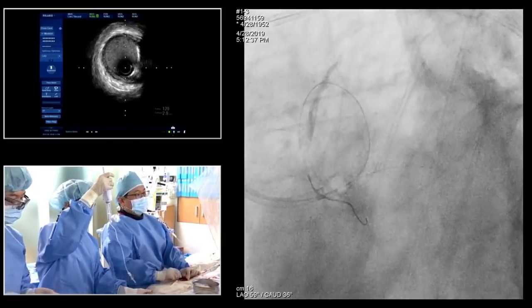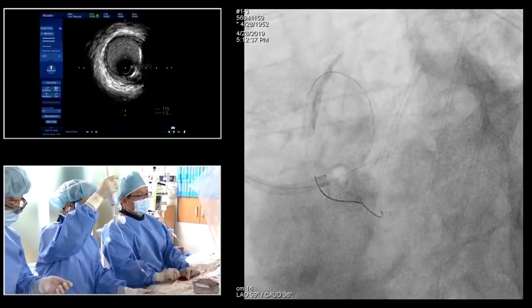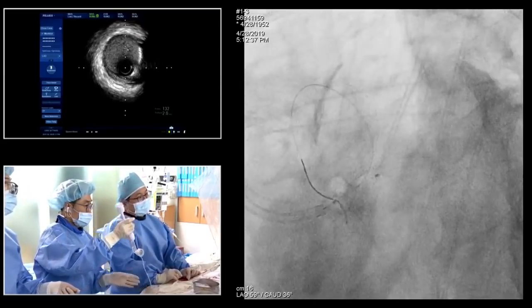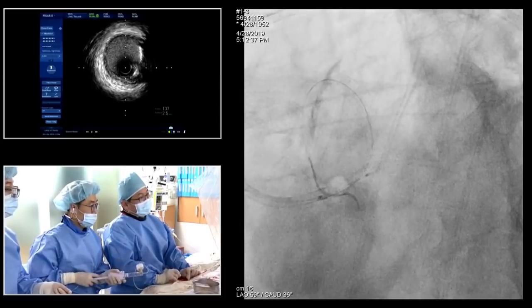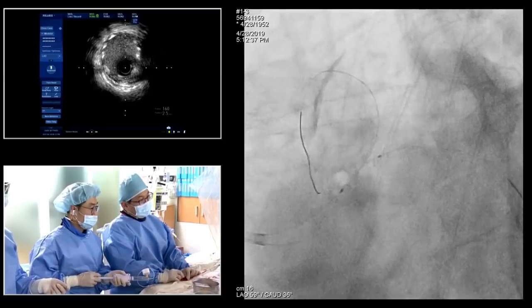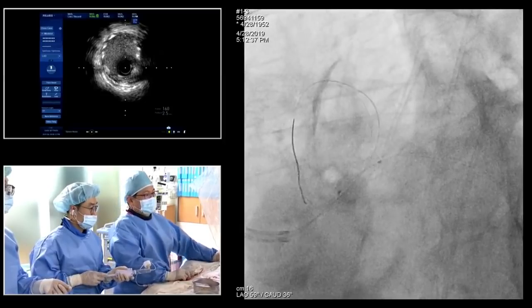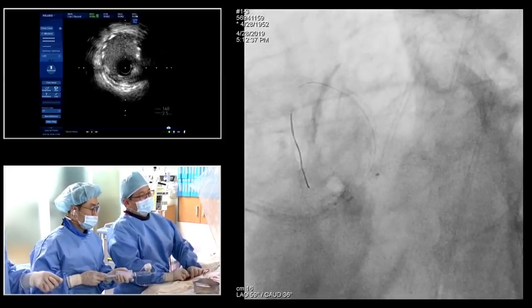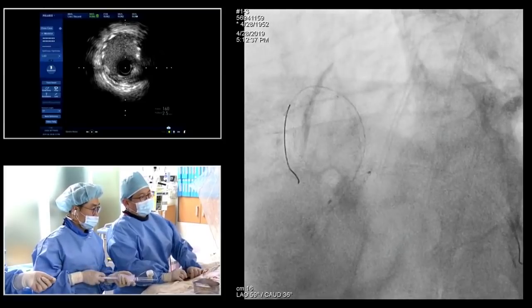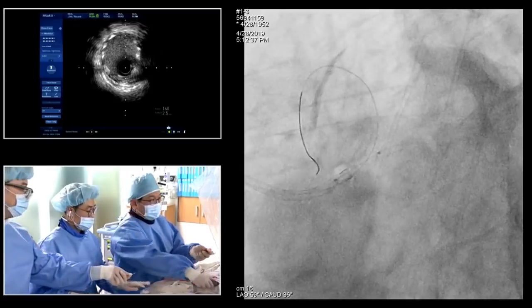So in the high pressure, 3.25, almost 30 atmospheres, it is almost 3.5 something. Sometimes the small balloon is necessary. It works. Okay, I will. This is the used one, so I hope it can pass through. 4.0, please.